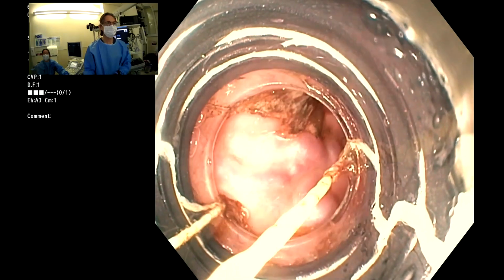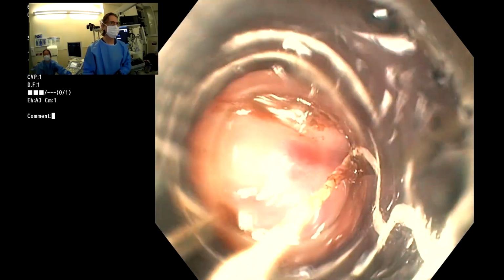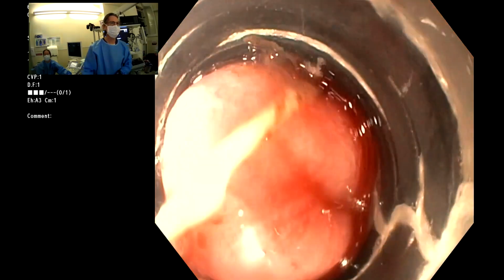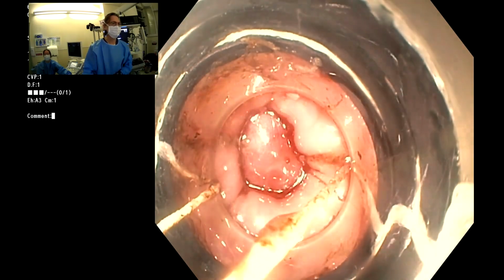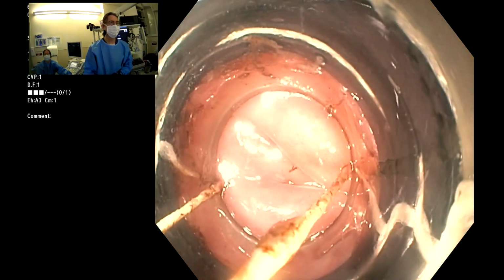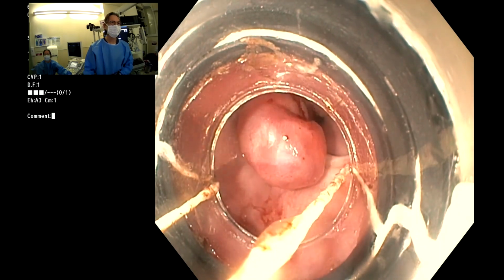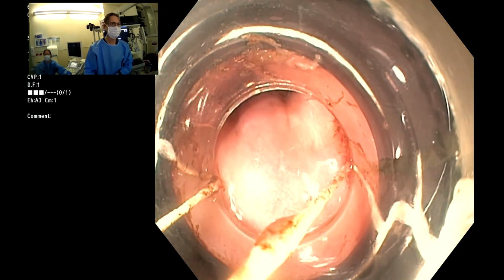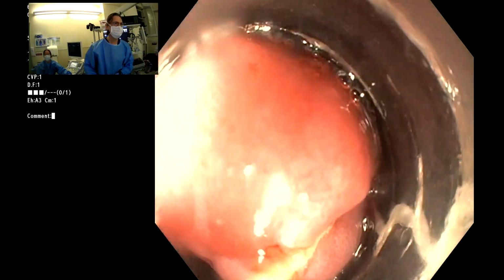Here is where I start to see some varices, so I'll start here, and we'll suck this gently up into the cap. All that's important is you tailor to the size of the varices. If they're very big, then you've got to suck more aggressively. But if they're small like these are, you don't have to fill the entire cap, because otherwise the patient really gets obstruction and can't swallow for a few days. So again, very carefully, you don't have to be too aggressive here.